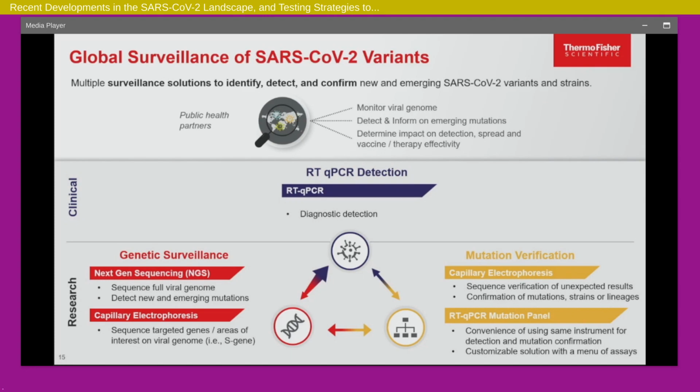The third part has always been the classic, conventional surveillance method, which is using next generation sequencing. This is looking at the whole sequence of the viral genome. You're essentially looking at every single nucleotide. So you can detect the known variants, as well as anything emerging and novel, you can also see the new variants that are coming up. And you can still do the capillary. I put this capillary as common to both because it's a sequencing technology.